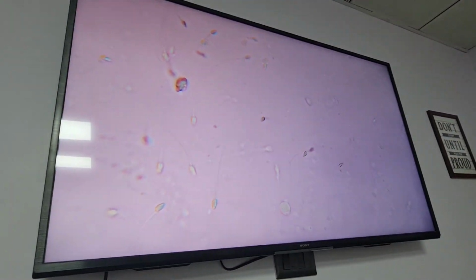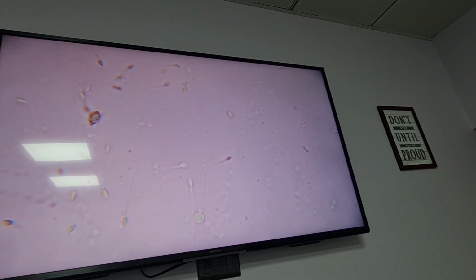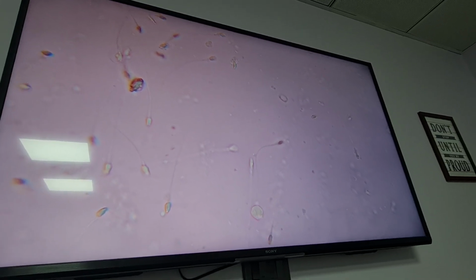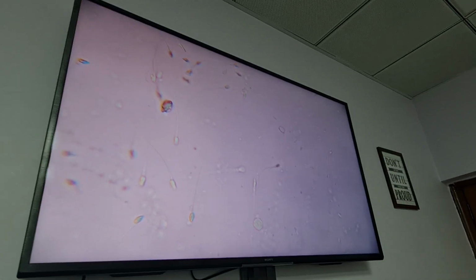So all of you can peep inside the microscope also later, and you can see a large number of sperms now floundering around. You can see one WBC which is hitting on the tail of the sperm. Can you see a WBC in front of you? Yes, sir. And that is probably a PR sperm, one more PR sperm. So the rest are slowly progressive, a confused sperm, and then there are a few sperms which are not moving. But how do you count them?